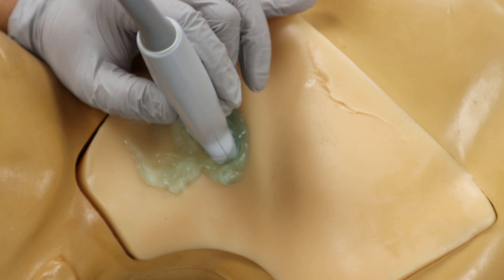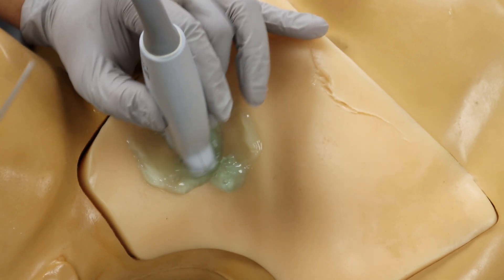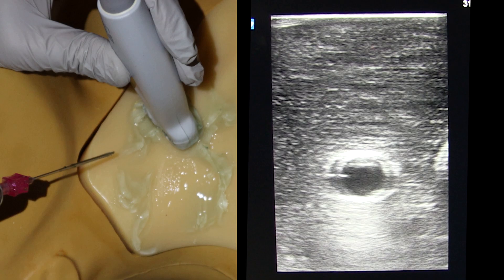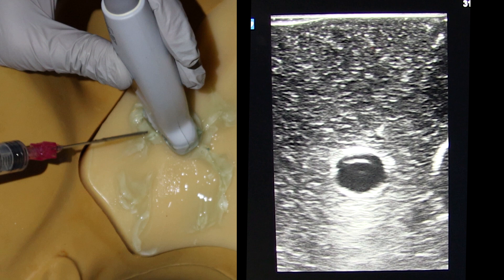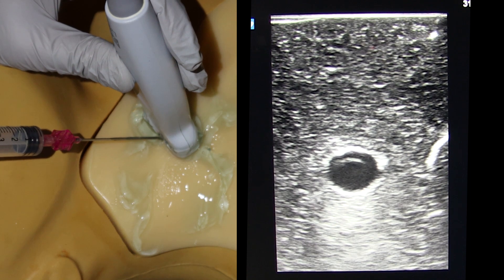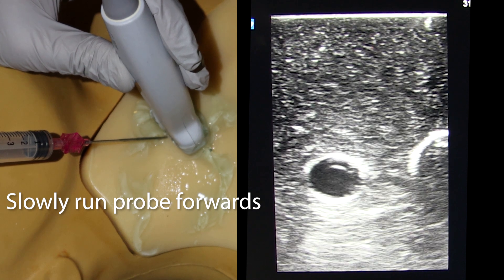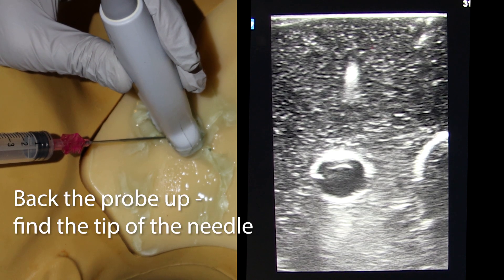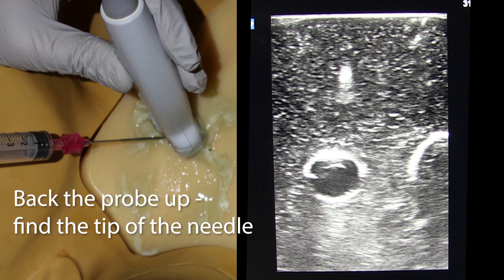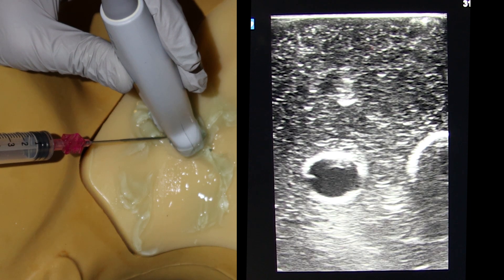Now for the actual needle guidance. I'll show you two main techniques — starting with my favorite, the creep method. Center the probe right over the vessel, then insert the needle right under the center of the probe. Very soon you'll see the needle appear near the top of the screen. When you do, stop moving the needle. Now slowly run the probe further down the vessel, away from the needle, until the needle disappears. Then back the probe up just a little until the needle comes back into view — that's how you know you're looking at the very tip of the needle.